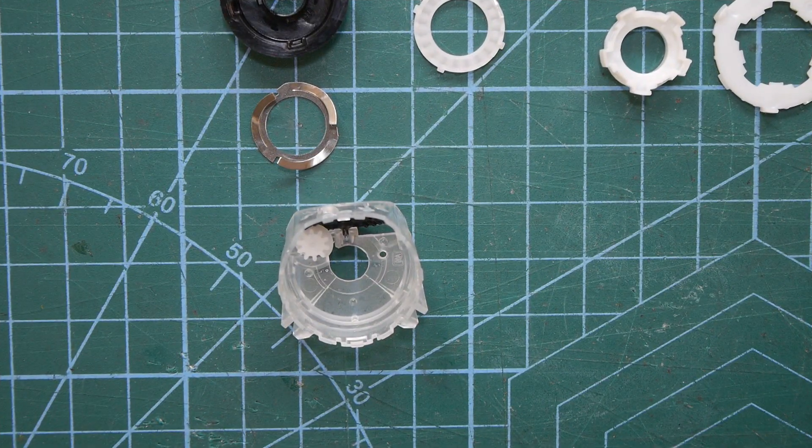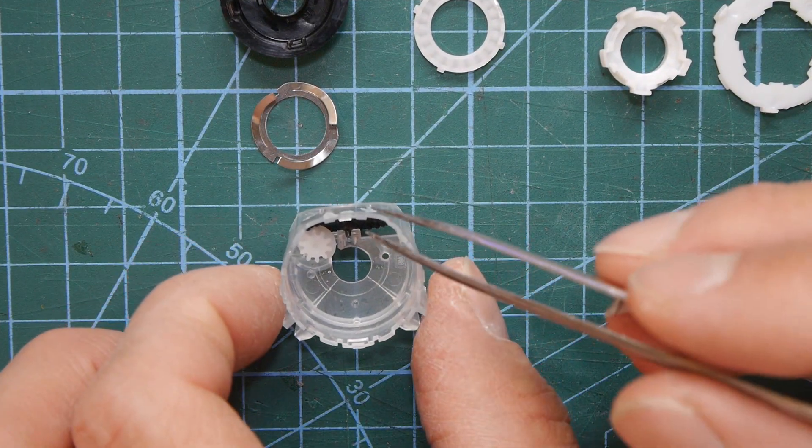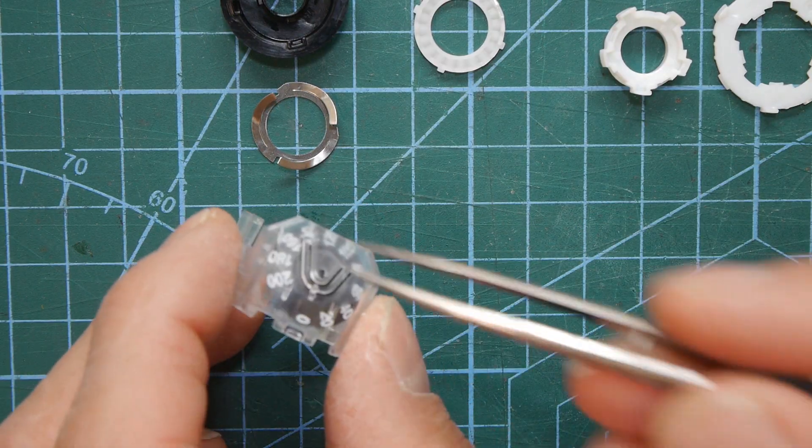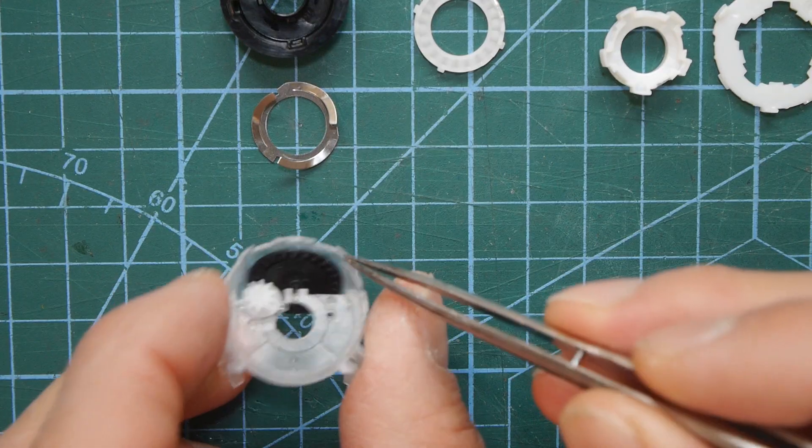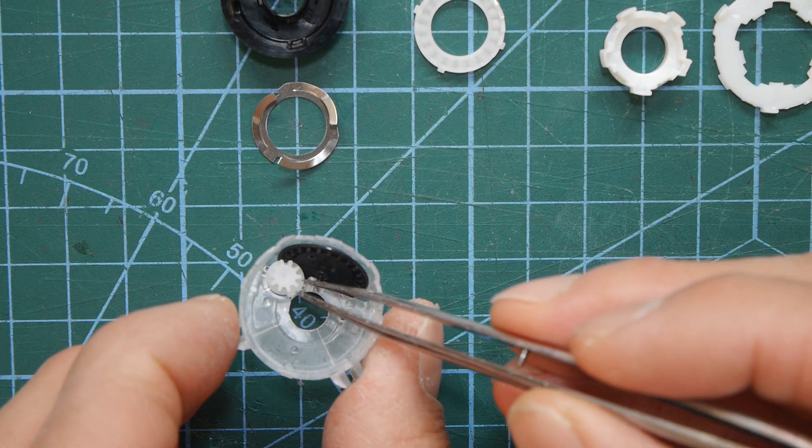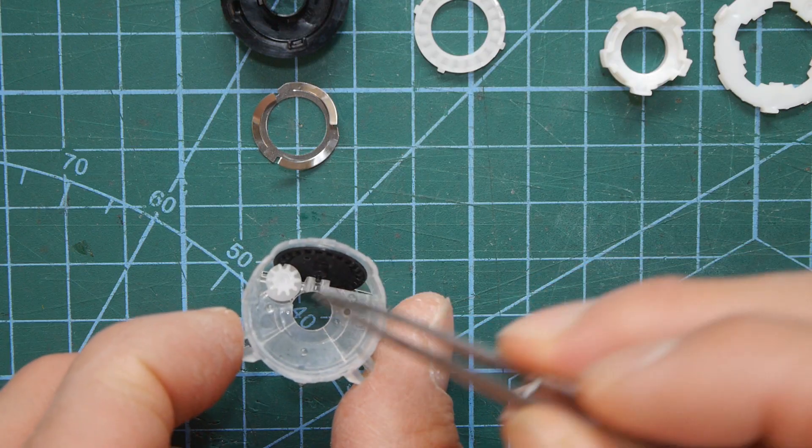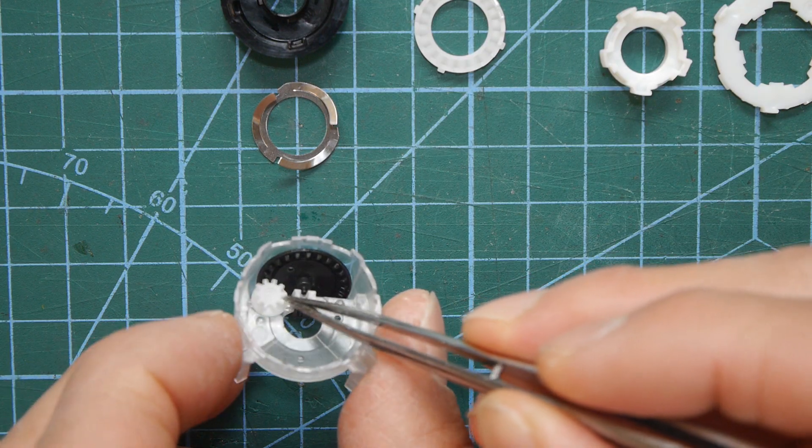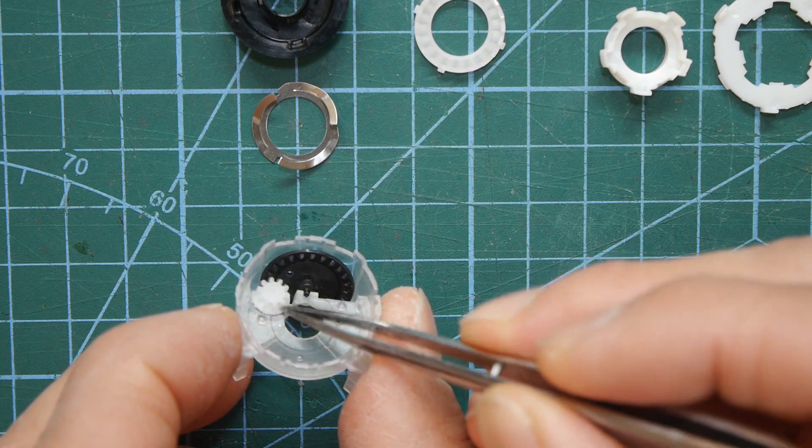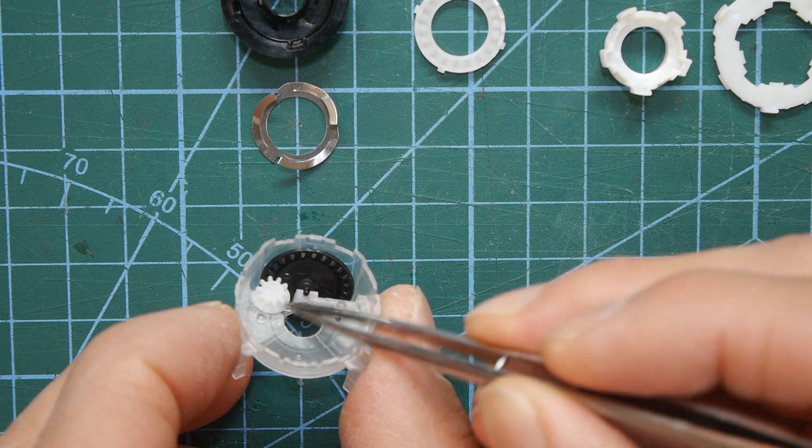So before this goes all flying all over the lab let's have a slightly closer look at what's going on inside. The counter wheel has got teeth on it and you can see the individual teeth here and then that's driven by a worm drive that itself is driven by this little gear here. If I rotate it that way can you actually see the black wheel turning.